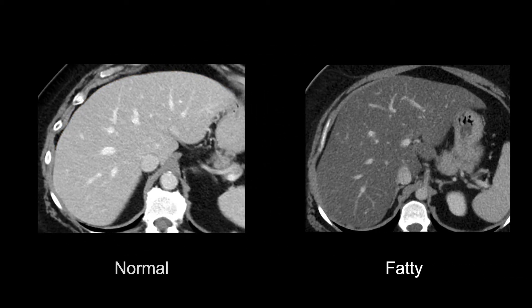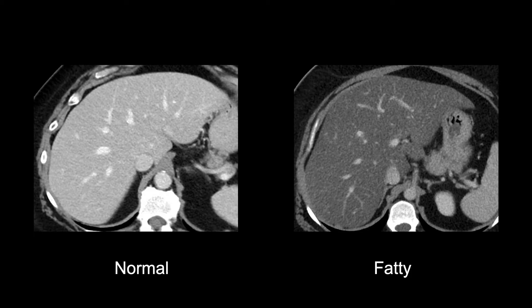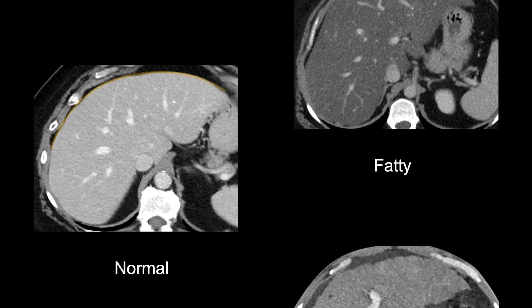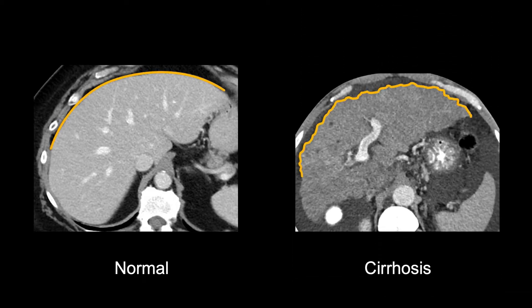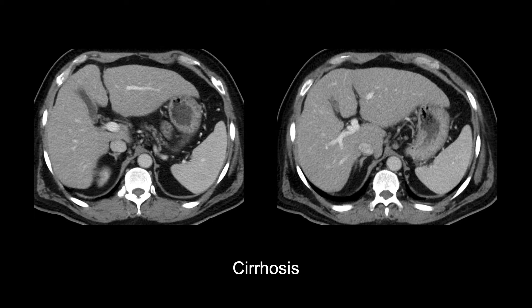Fatty liver, or steatosis, will appear less bright than normal liver tissue due to fat infiltration throughout the organ. Cirrhotic livers often have a nodular, bumpy surface. Cirrhosis can also present with more subtle nodularity of the liver surface, but will often give other hints of the diagnosis, including widening of the fissure and enlargement of the left and caudate lobes.